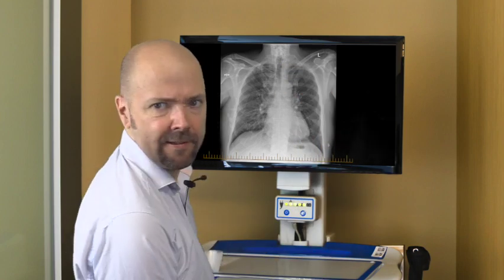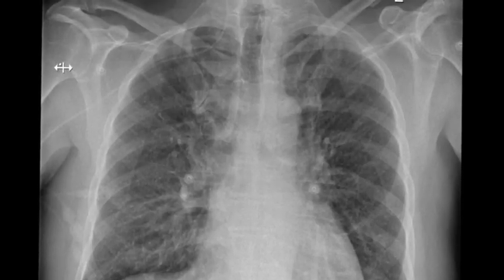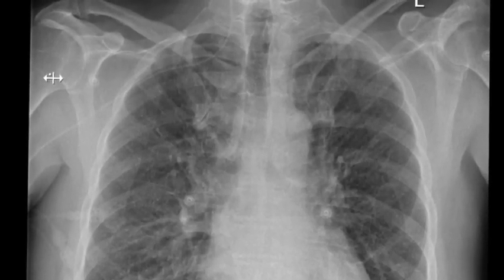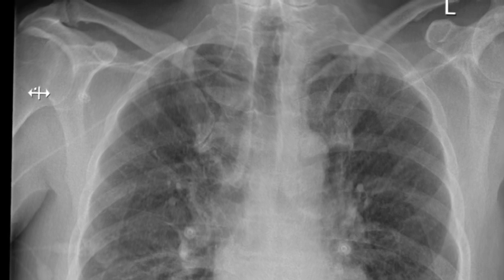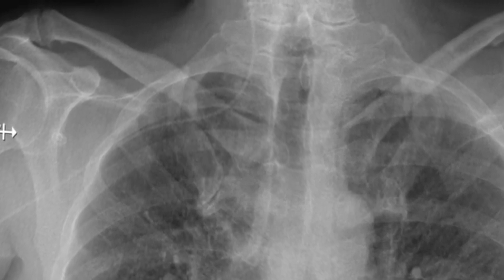Don't you hate it when that happens? You've gone to all that trouble of putting in a peripherally inserted central catheter, it's all gone brilliantly, and then you get the x-ray back and the tip is in the internal jugular vein. We'll demonstrate a great tip for avoiding this frustrating complication of PICC line insertion on this episode of Osler Shortcuts.